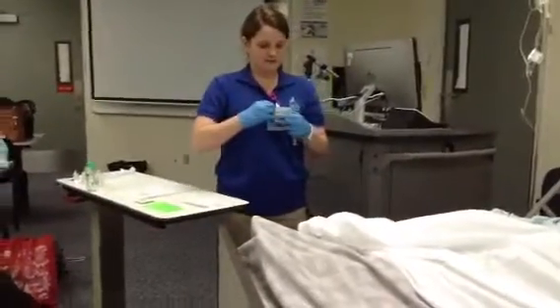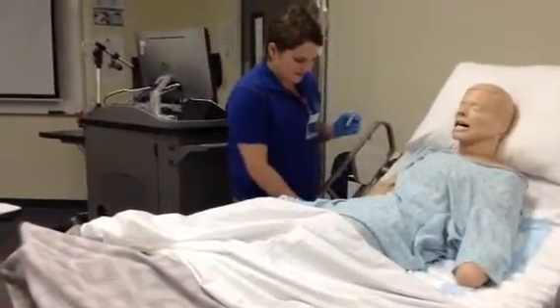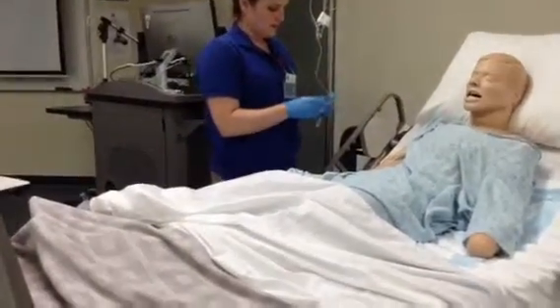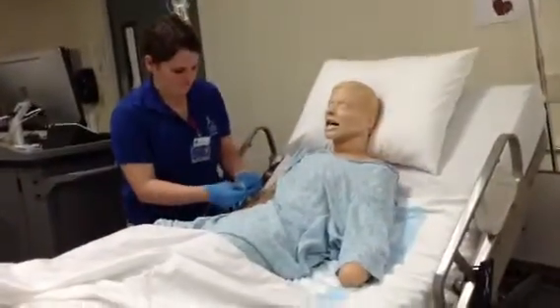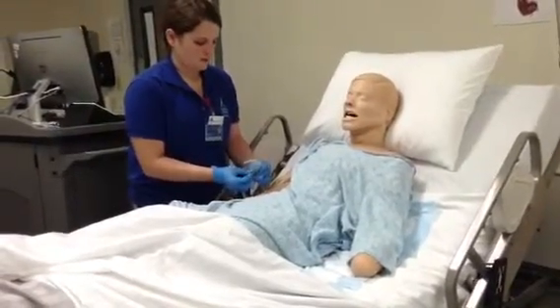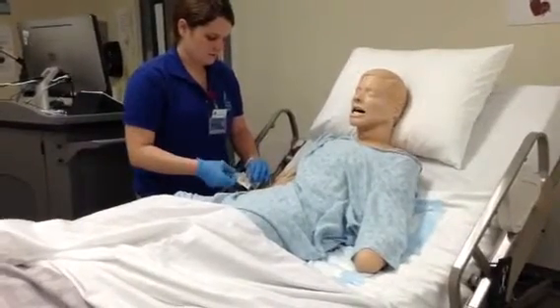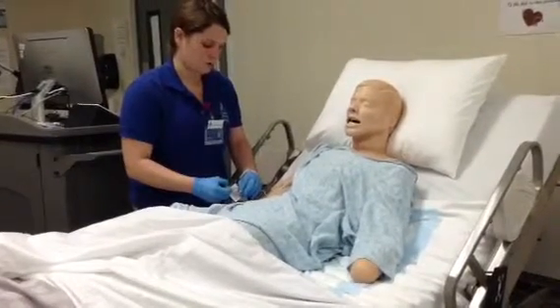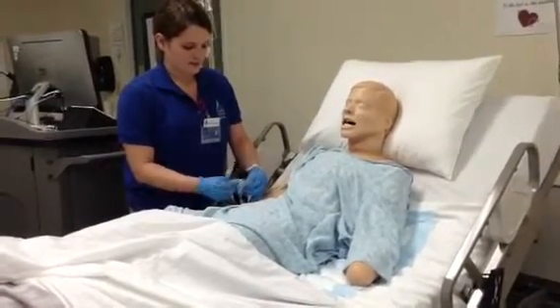I'm going to check his IV patency. Make sure there's no redness, phlebitis, infiltration. I don't see any. Do you have any pain right there? No. Alrighty, so I'm going to go ahead and wipe off his port with some alcohol. Okay, and I'm going to aspirate first. Make sure I got a blood return. Right, and then I'm going to do 3 milliliters, push, pause, push, pause, push, pause. Okay. And then I'm going to wipe off his port again.